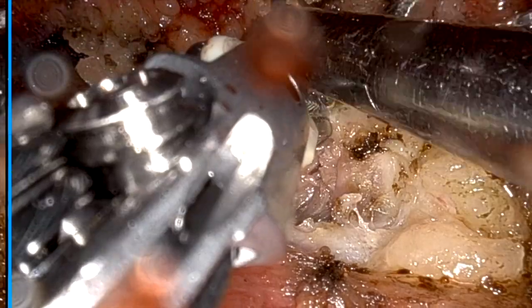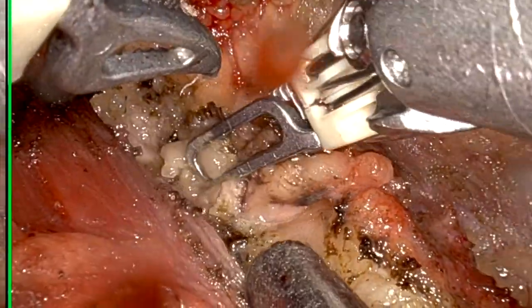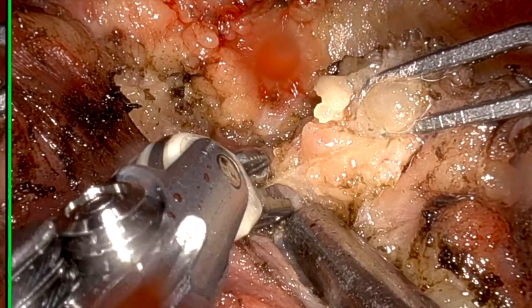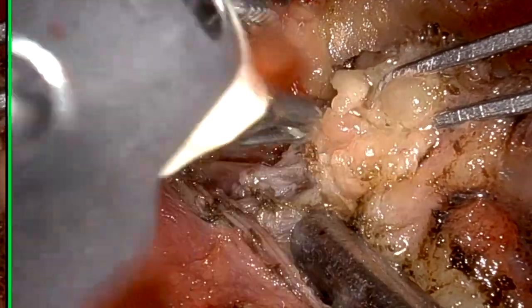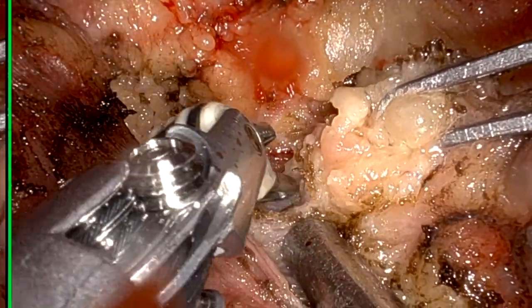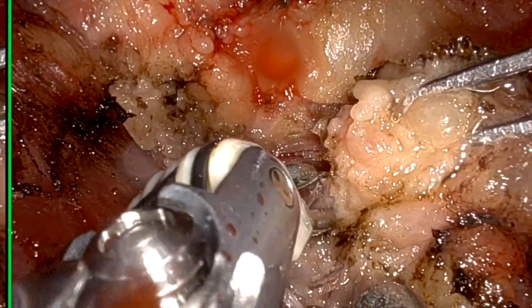Duration is one disadvantage of robotic neck dissection. I finish in 1 hour while doing open neck dissection, but for this surgery my console time was 1 hour and 55 minutes. Add 30-35 minutes for flap raising and retractor fixation. So a total of 2 hours 30 minutes or 2 hours 35 minutes is the actual time.